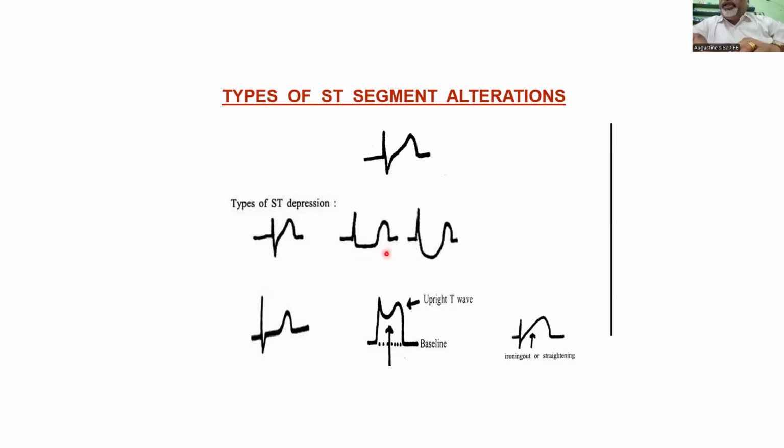Anybody? So we can take it as losing concavity is the earliest stage. Yes, sir. That's the earliest, which is missed by everyone, many people. That is what I don't want to happen. Every one of our students, every family medicine student, should not miss this.